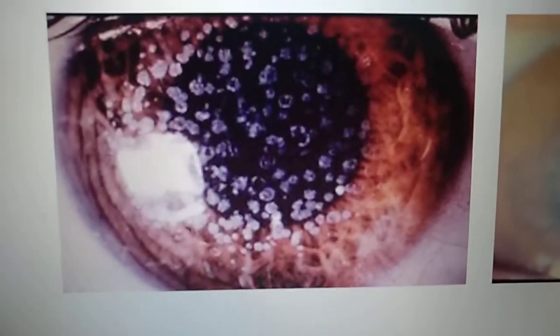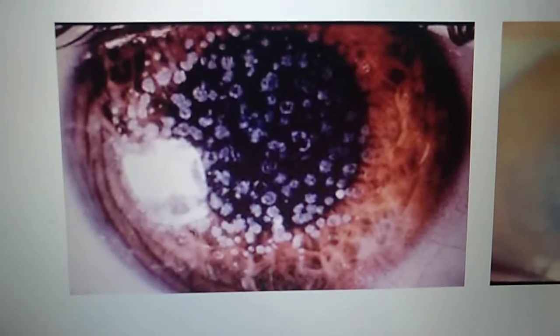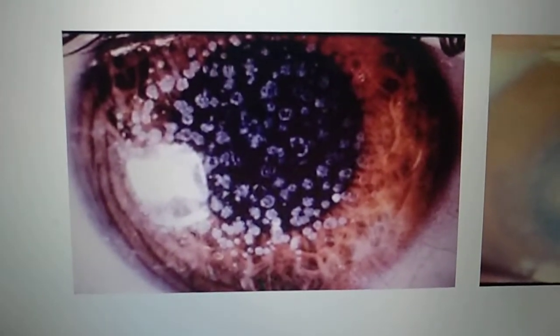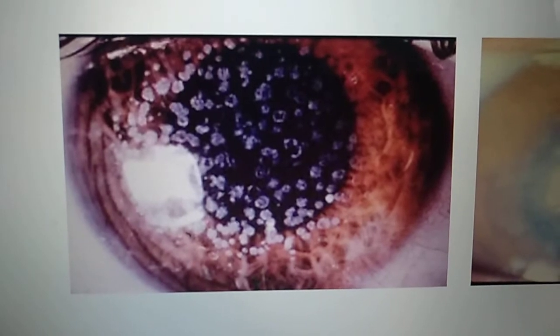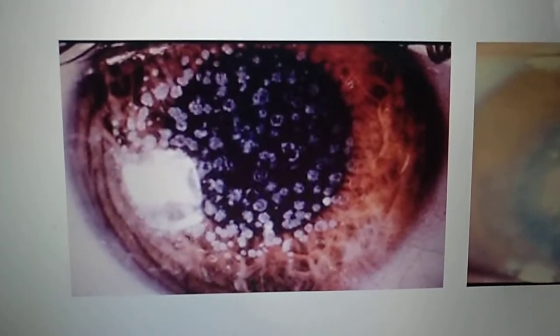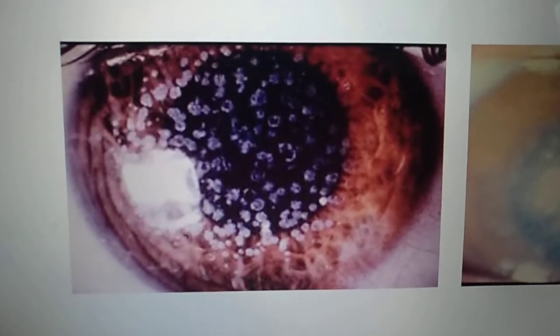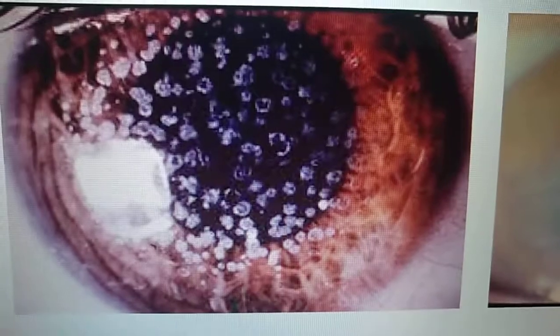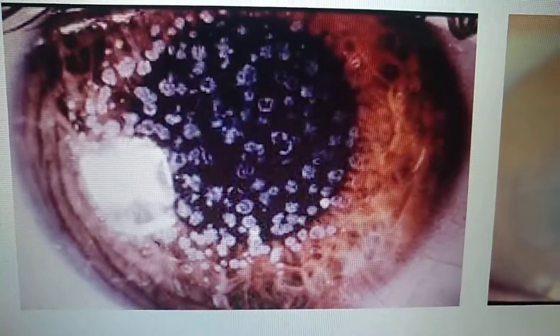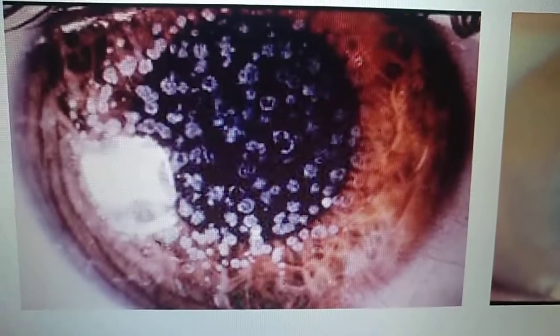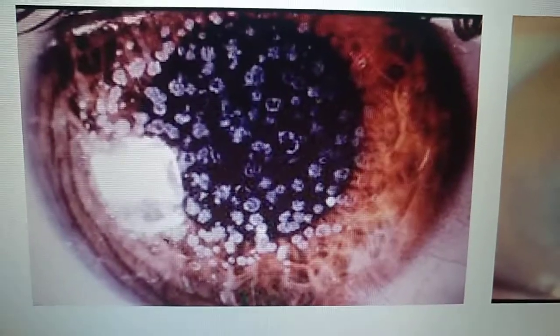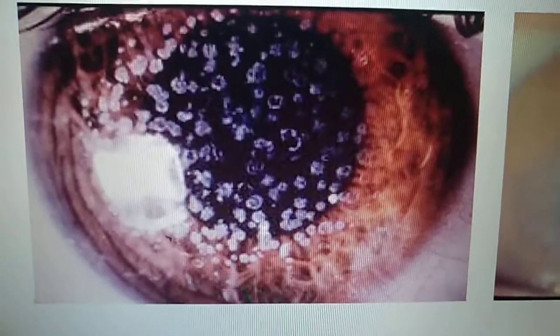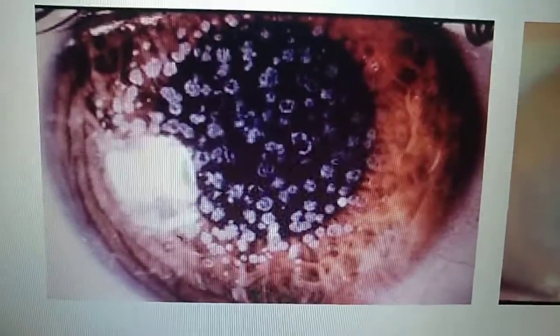First, zoom at figure one — that is the granular dystrophy. Here you can see that there are popcorn-like opacities throughout the central cornea, which basically goes up to the mid-peripheral region. In the periphery there are very few opacities; they are more concentrated in the center. Also, in between the opacities, the area is clear — so between any two opacities there is a clear area of cornea. This is the main identifying feature of a granular dystrophy.